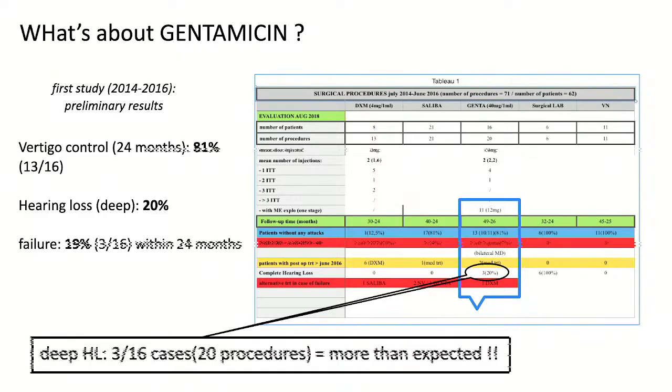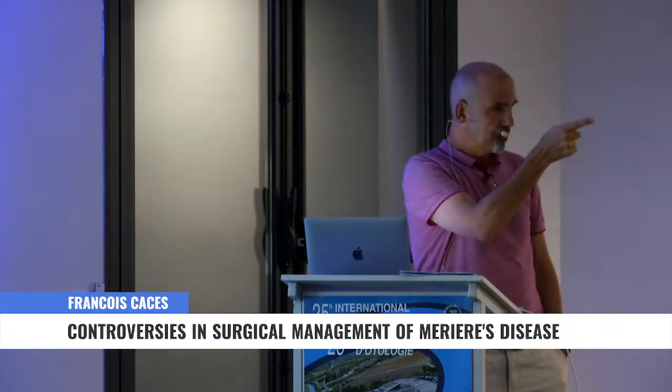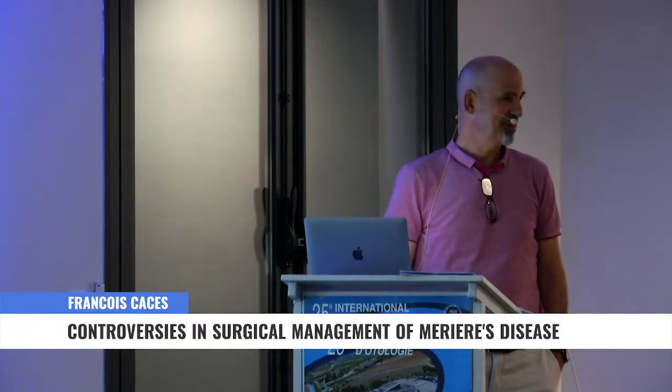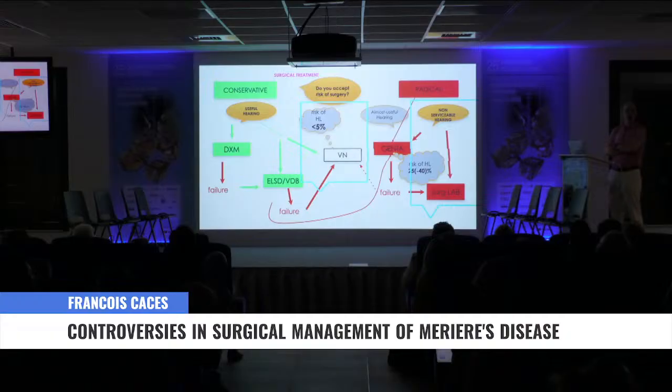So it is one of the questions, but we don't have time, so I think I move after to the surgical treatment that I performed yesterday. Yesterday I performed a surgical labyrinthectomy, and a question of Joachim at the beginning was why don't you insert a cochlear implant at the same time? Because we don't have a cochlear implant, but I fully agree. It's a very good indication, of course.